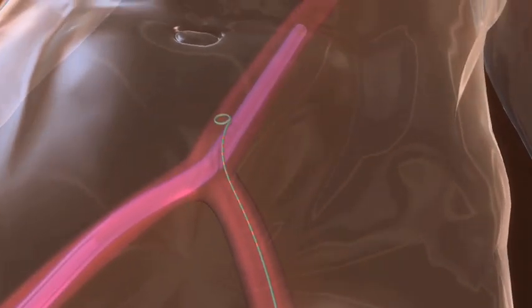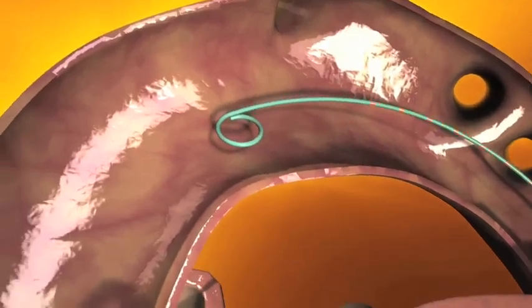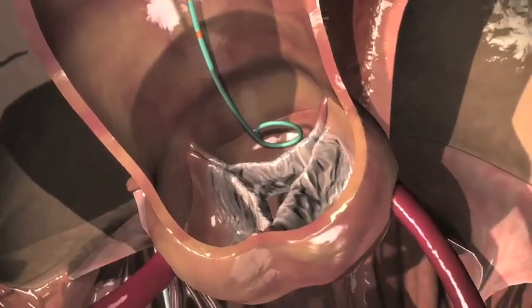Now, advance the 5 French graduated pigtail catheter to the ascending aorta and place the tip in the non-coronary cusp of the native aortic valve. The pigtail catheter will serve as a visual reference marker during deployment.